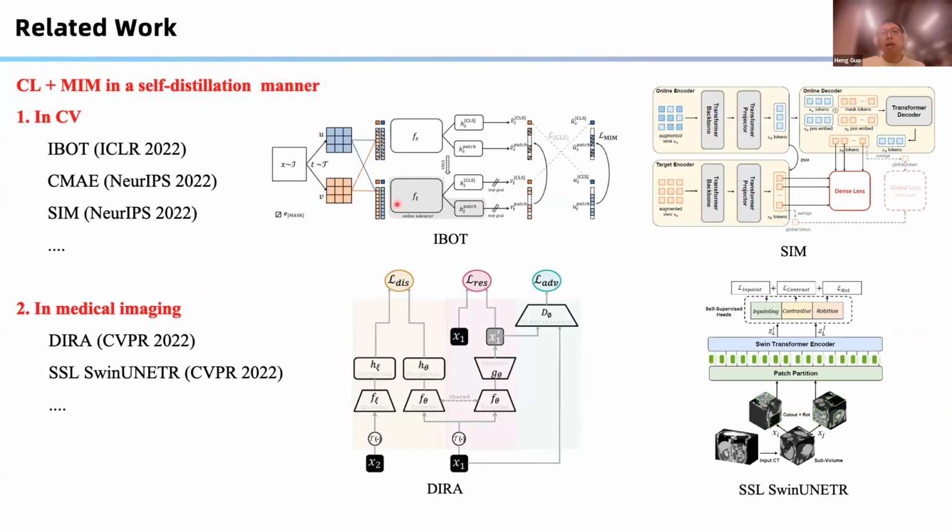For example, one method samples 2 instances from a given input, then applies masked data augmentation and the regular image augmentation to each instance, resulting in 4 inputs. These inputs are then fed through the network, and the model receives cross-class token supervision and in-patch reconstruction supervision.